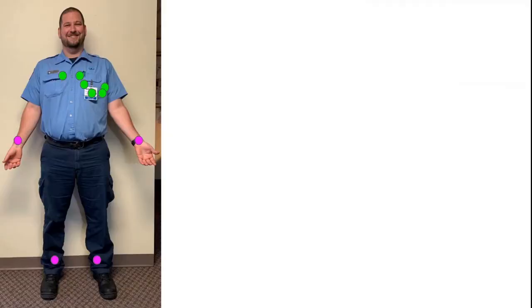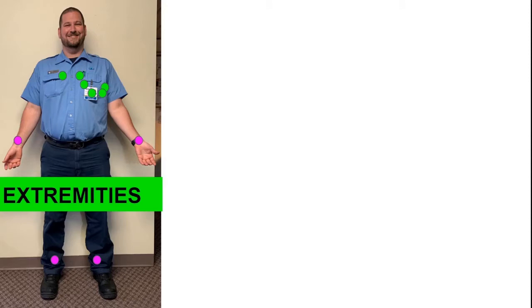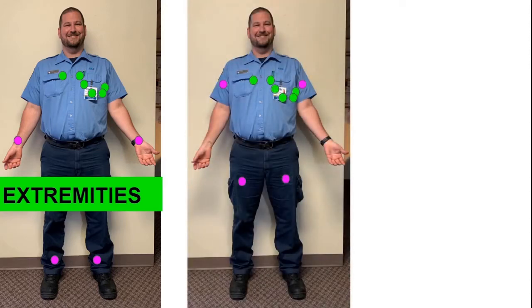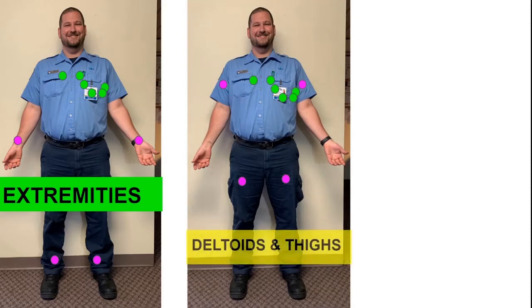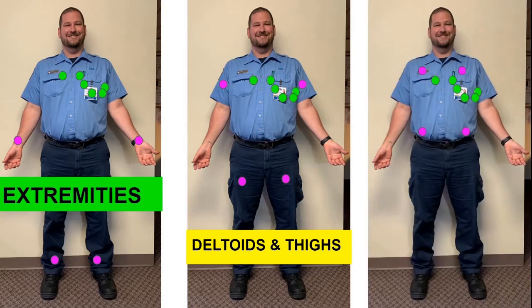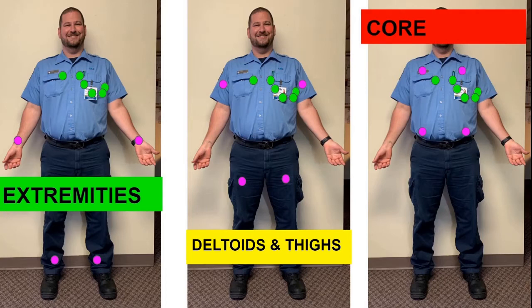Here we have me with the precordial leads in green and the limb leads in pink. And you'll notice they're on the wrists and the ankles, the extremities of where they're supposed to go. Here we have me with the precordial leads and the limb leads, but they're on the deltoids and then the thighs. And then here we have me with the limb leads on the core and the precordial leads on. And that is going to drastically change the EKG.